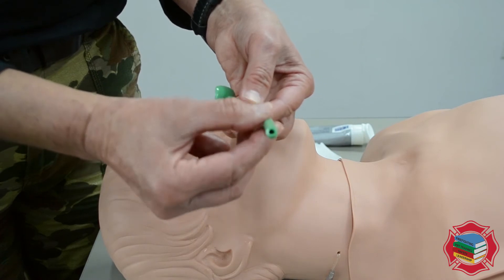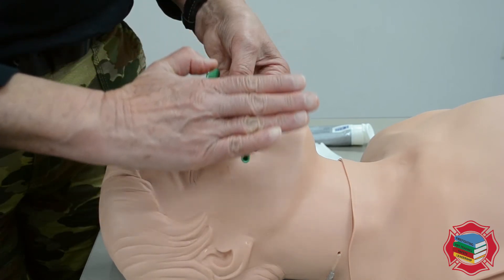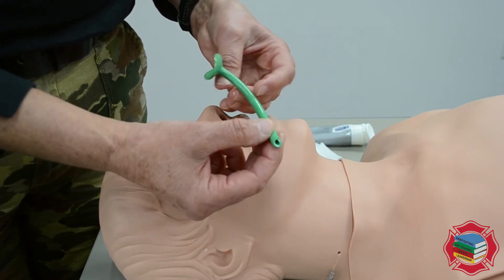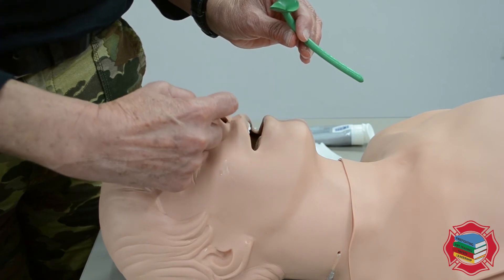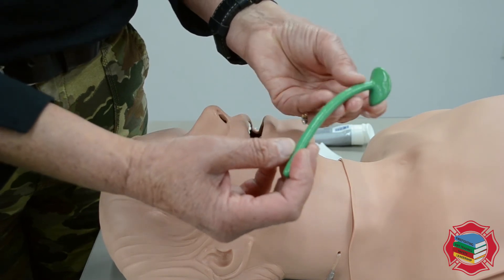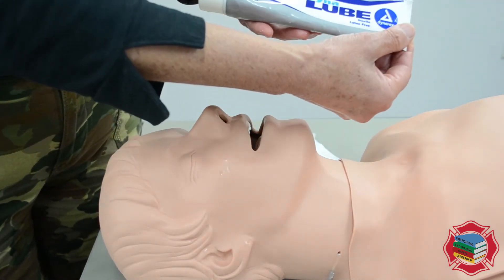You'll notice that there's an opening in the airway at the distal end, and it's cut on an angle which is called a bevel. When this airway is inserted, it's inserted with the bevel facing the septum, which is the divider between both of the nares. This airway is meant to go into the right nare.